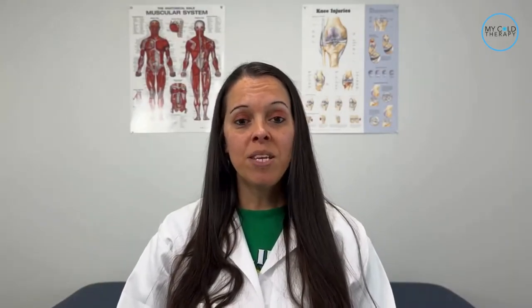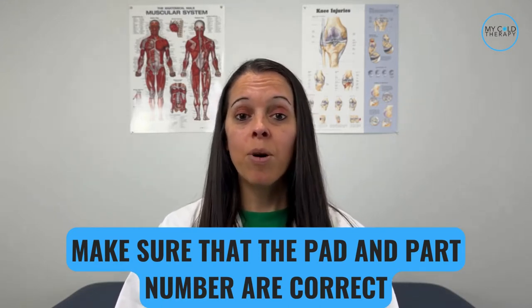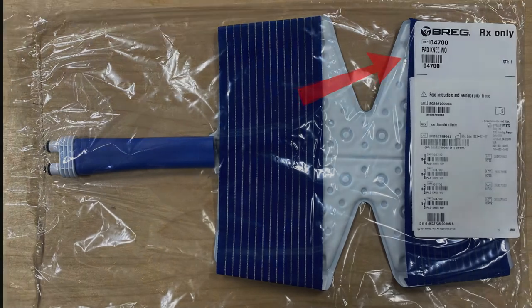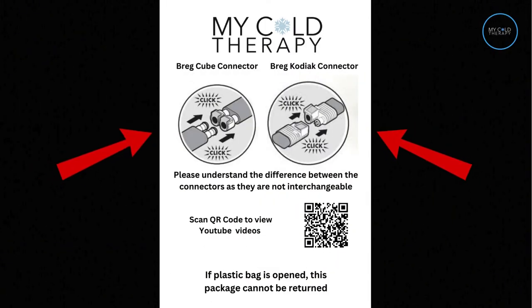The first thing we need to do is make sure that the pad and the part number are correct. You would do this by looking at the front right corner of the pad where the part number will be listed on the white label. Notice this is a sealed bag, and once the sealed bag has been opened, it cannot be returned. You will be getting a flyer with your pad that shows the different connectors. The Cube and Kodiak systems have different connectors, so please be sure to order the correct pad.